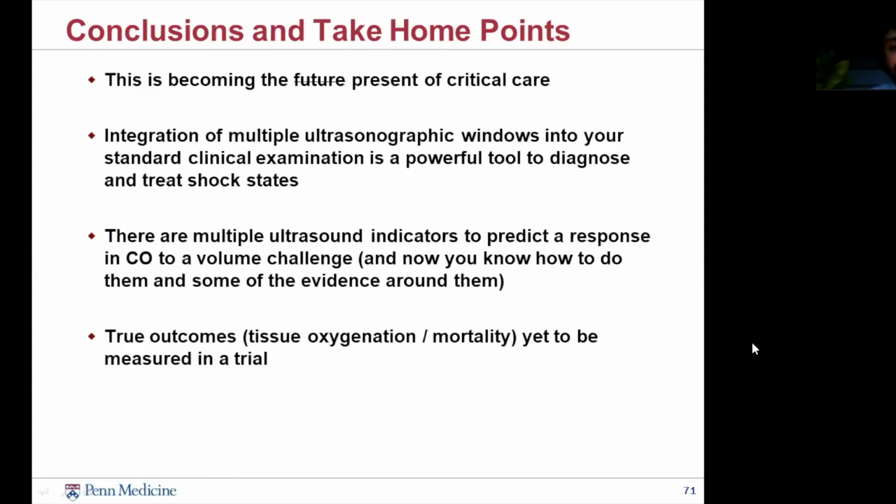At the same time, if you have somebody who's very experienced with this and who is able to get reliable measurements, this is as good, if not better, than measurements of aortic outflow, because it's so much easier to access the carotid with an ultrasound as opposed to getting a view of the aorta.